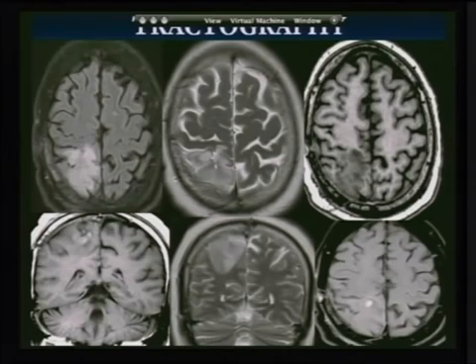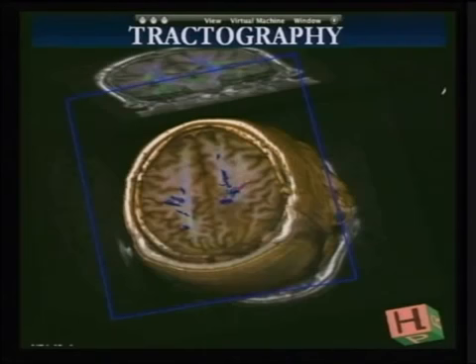Another patient, and this patient can summarize the advanced neuro MRI package. There was a tumor which had been excised and radiated, and the patient came back 2 years later with epilepsy and mild left hemiparesis. The area high up is hyperintense on T2, hypointense on T1, with small focal enhancement and mild mass effect. So where are the tracts, is this a recurrence, or is this radiation necrosis, and what are the limits of the spread or infiltration?